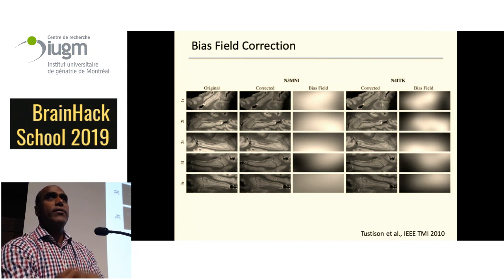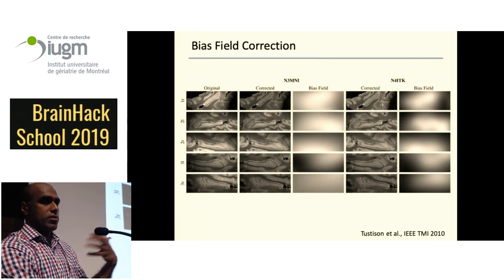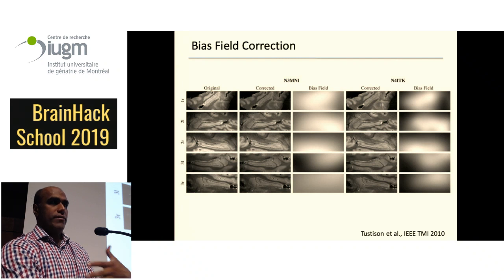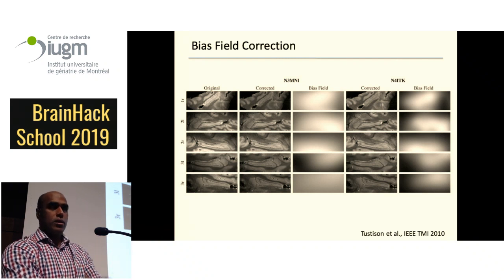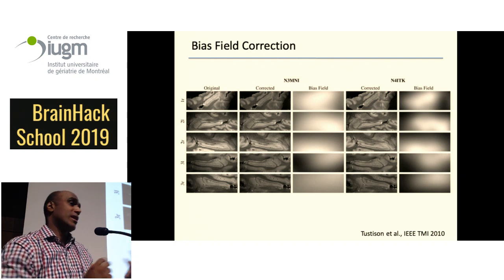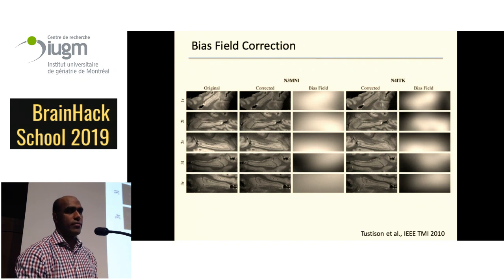What's interesting is that N3 was created for 1.5T data in the mid-90s, which had very nice, smoothly varying inhomogeneity profiles, but we all want better resolution and better signal and better contrast, but that comes with other costs too, right? So that we have to account for.